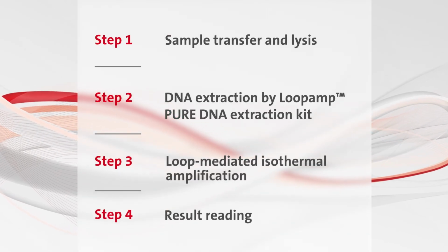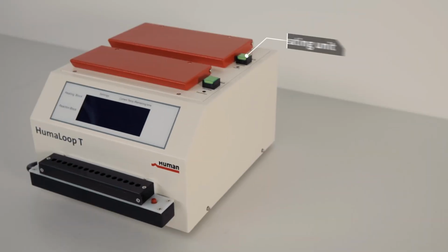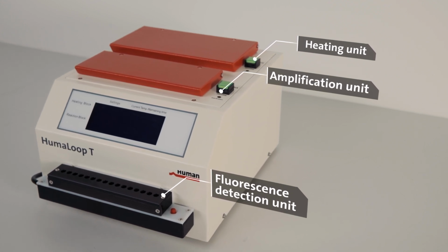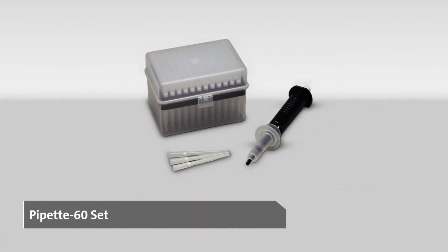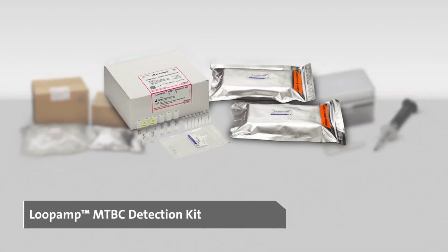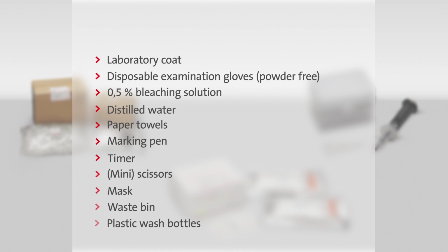All steps are performed with the help of HumaLoop T, which combines a heating unit, an amplification unit, and a fluorescence detection unit. To get started, you need the Pipette 60 set, the Loopamp PURE DNA extraction kit, the Loopamp MTBC detection kit, and some general laboratory materials.